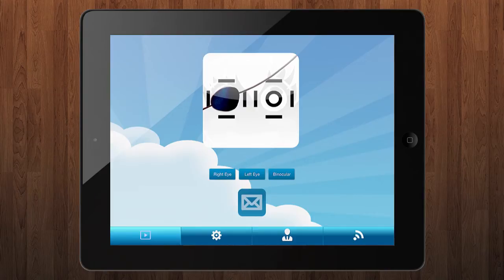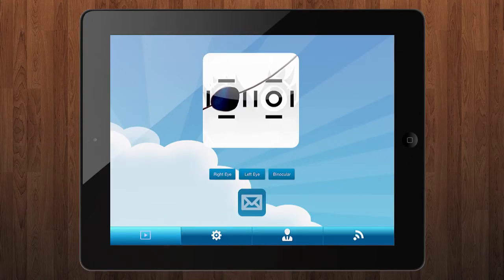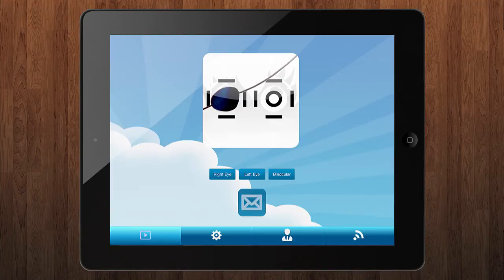When you start the application you can see the main screen. To navigate between screens you only have to press on each of the buttons at the bottom bar.